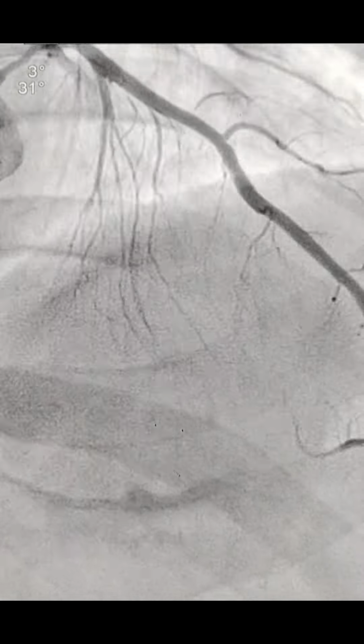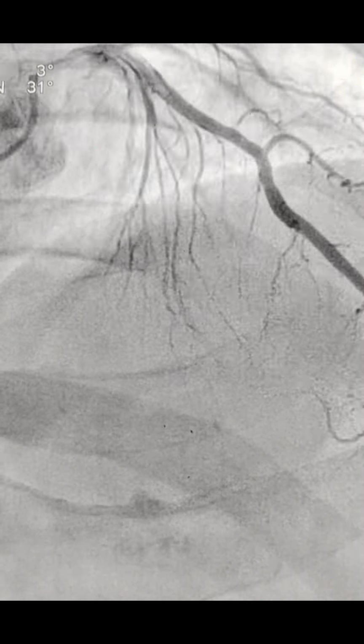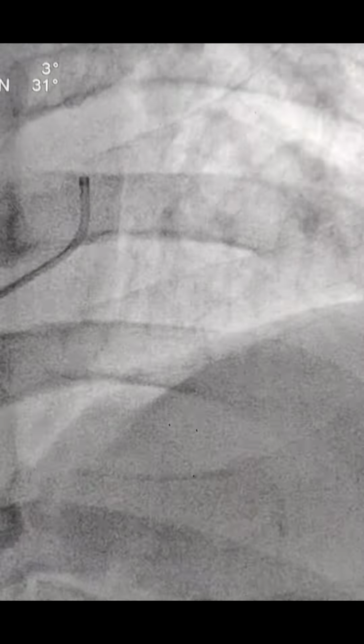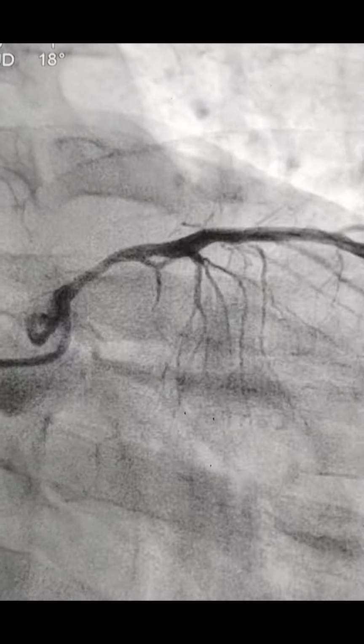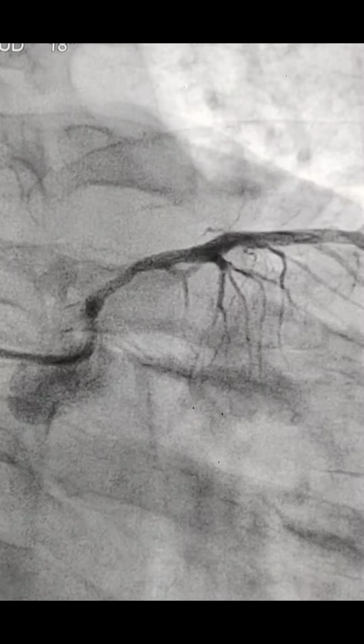So we changed to a JL catheter, and this is how we directly engage the LAD, and you can see there is a lesion in the ostioproximal LAD. This is a separate origin of LAD. You don't see the LCX here, and there was no left main at all. So we decided to do angioplasty to the ostioproximal LAD.